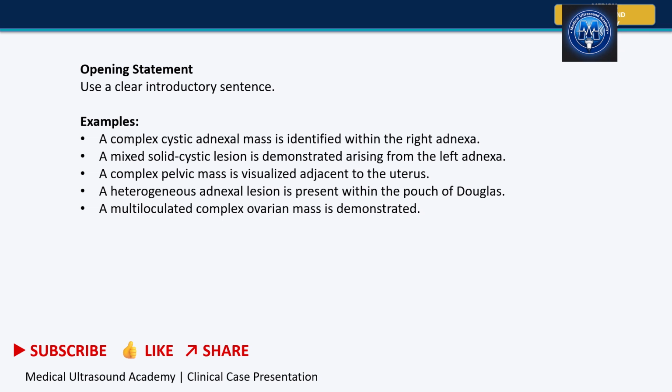So, the opening statement. Use a clear introductory report sentence. Examples: a complex cystic adnexal mass is identified within the right adnexa.